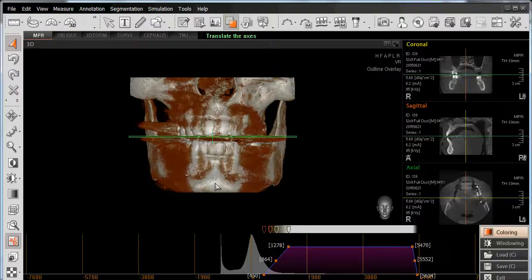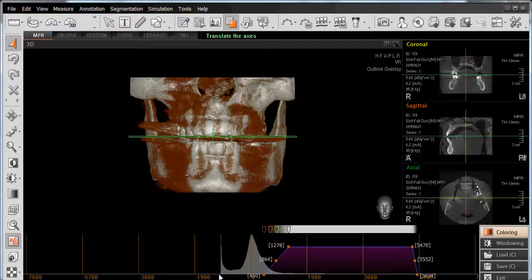The cortical bone is typically 1000 and higher. Enamel of the teeth is about 2000. Metal is 3000, and so forth. The white numbers here identify our density range that we've selected. In this case, the number 450 identifies the low end of my density scale, indicating to the software to segment out any density less than that value. There's also an upper end, indicating to the software the upper limit of the density to view — in this case, 5634.